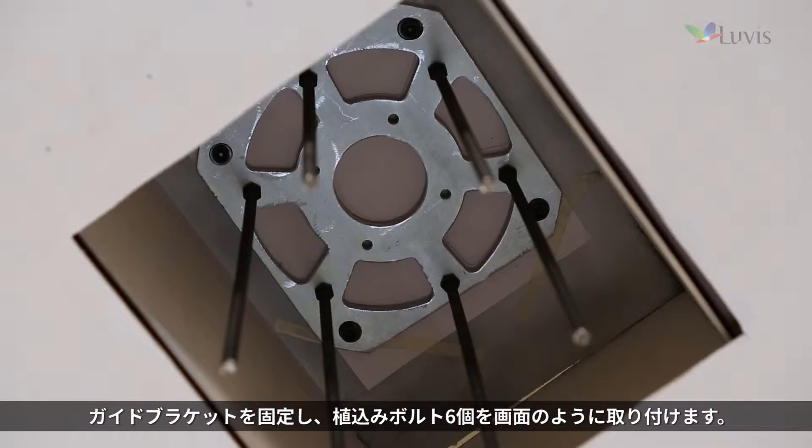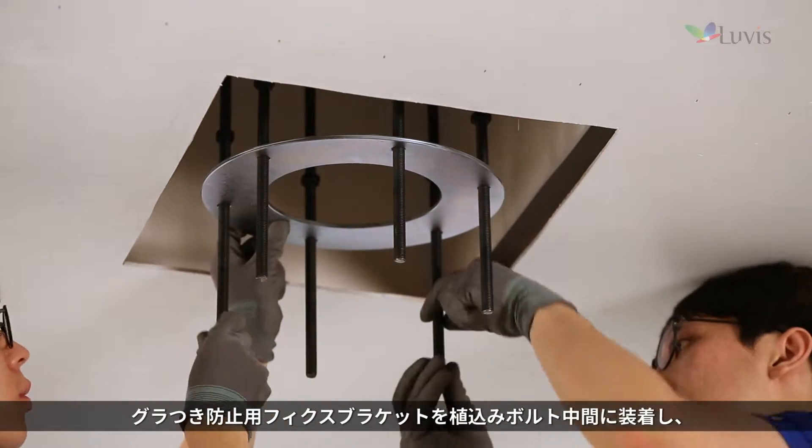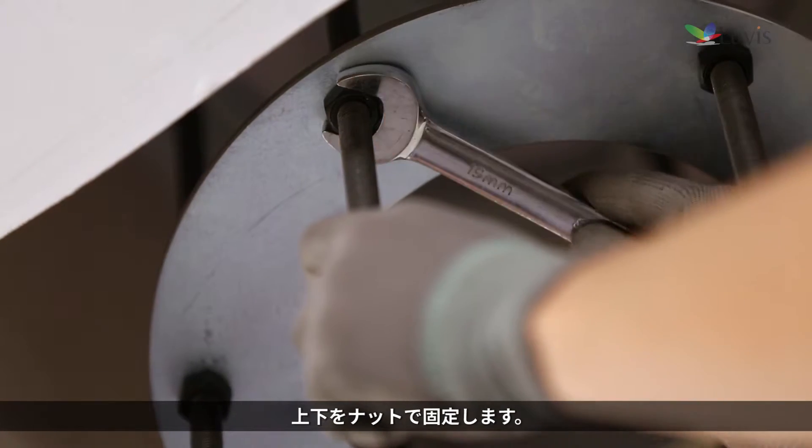Fix the guide bracket and install 6 stud bolts as seen on the screen. After installing the fixed bracket for preventing movement in the middle of the stud bolt, fix it with the up-down nut.